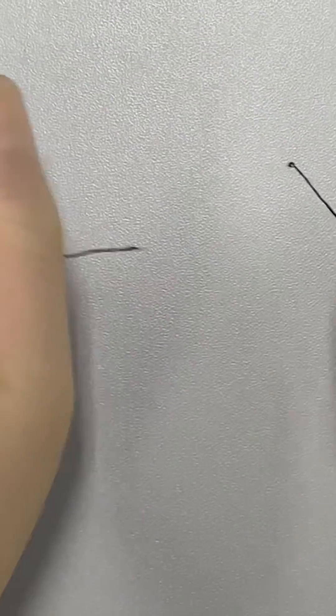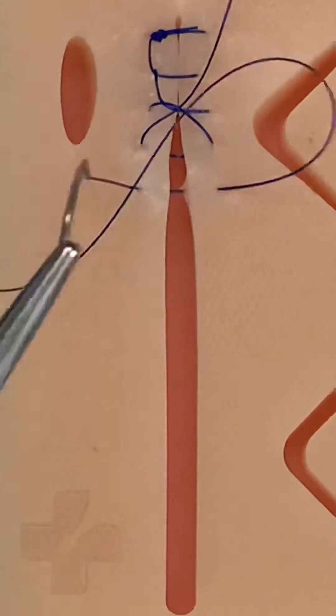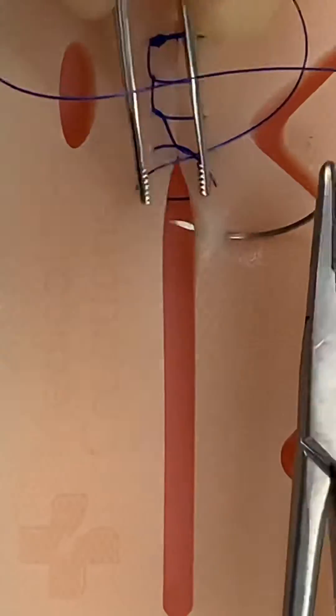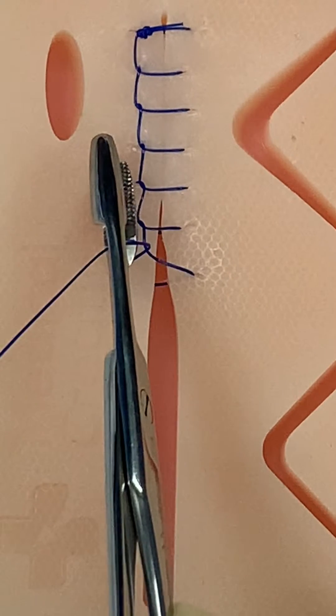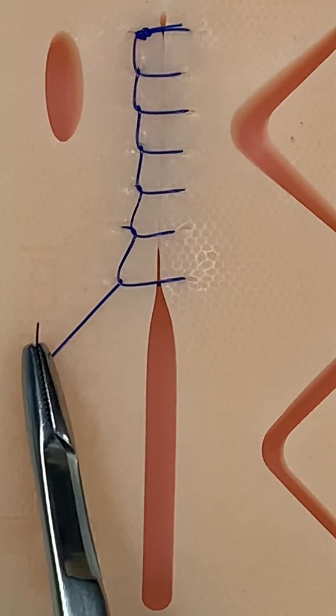This also commonly happens when trying to over tighten your knots, or when using these Olsen-Hagar needle holders, which are needle holders that have scissors built into them. Sometimes when you try to grab the suture, you end up grabbing it with the scissor portion and end up cutting it.